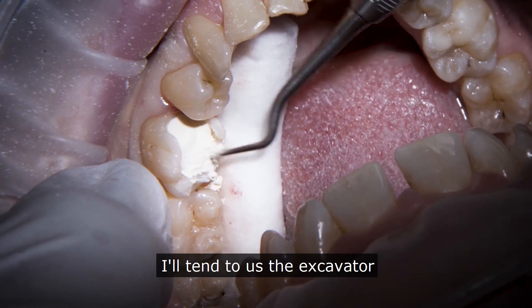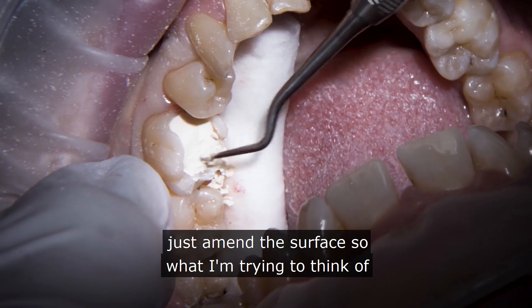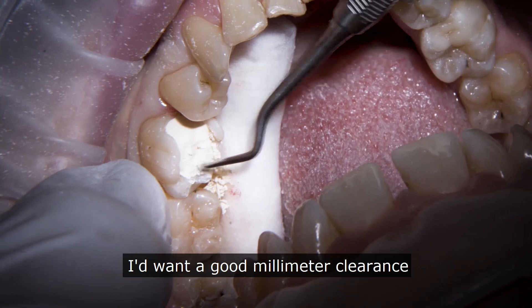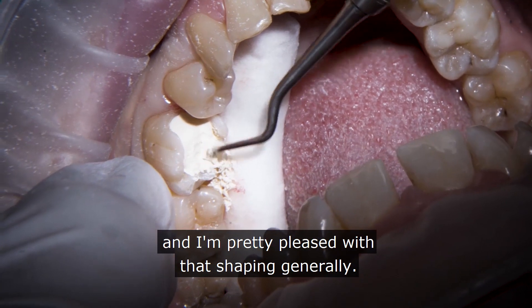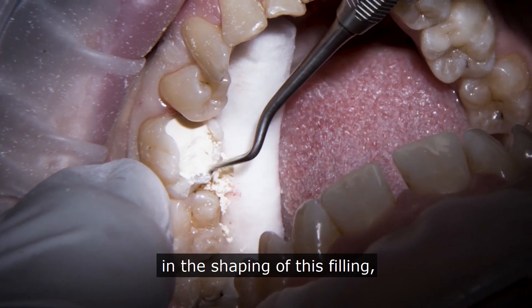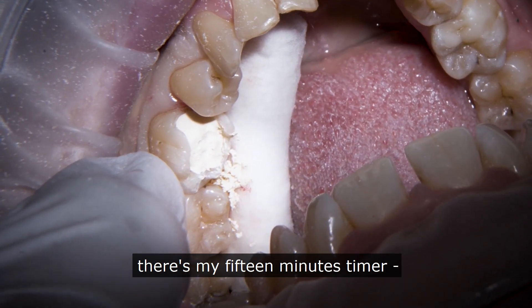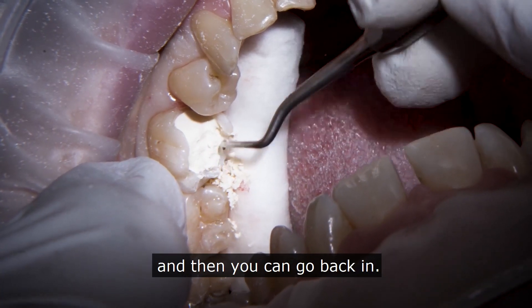If I want to take anything off occlusally I'll tend to use the excavator and just amend the surface. I'm trying to think about the thickness I want on my filling material — just creating enough depth occlusally, wanting a really good millimetre clearance across there. One of the things you really need to be aware of with biodentine is that it doesn't bond to the tooth straight away. It takes several months to really form those links with the dentine — I've gone back into biodentine I've done on lateral perforation repairs on roots and it's just like the dentine, fused with the natural dentine.